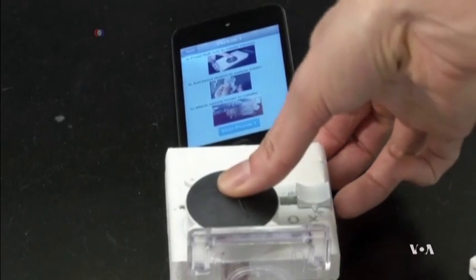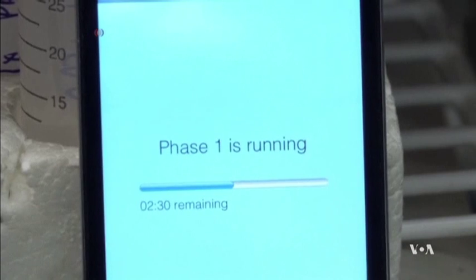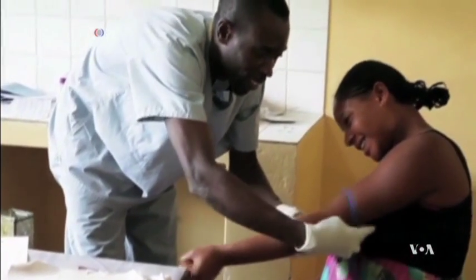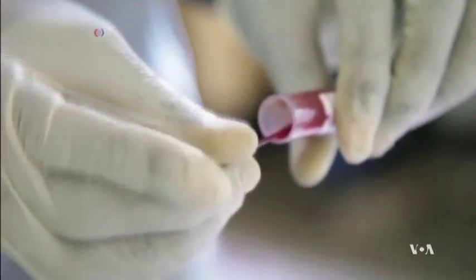For 10 years, Sia and his team worked to develop the attachment they say can perform nearly as well as $18,000 laboratory equipment. Instead of doing a blood draw, getting that sample sent to a lab, you can actually do it on the spot with just a finger prick of blood, and you get the result in 15 minutes with very similar quality as doing the test in a lab. A small-scale testing of patients in Rwanda provided highly accurate results.